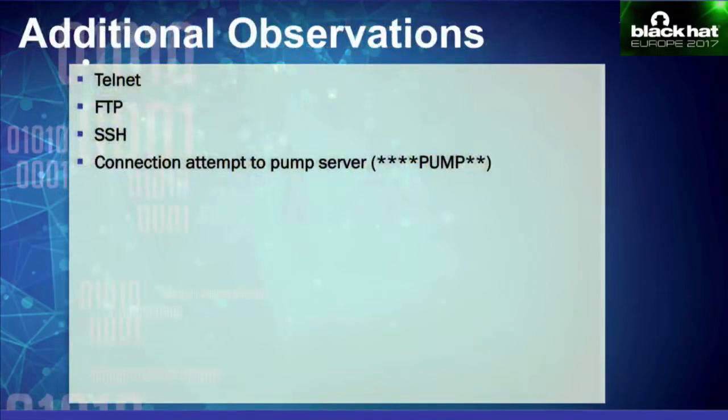Right, so we made some more observations. Once that was done, we noticed that it exposes Telnet, FTP, and SSH. We tried to brute force into these services. That didn't work, but I think that just means we need to buy better word lists.